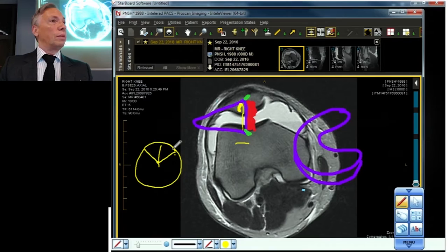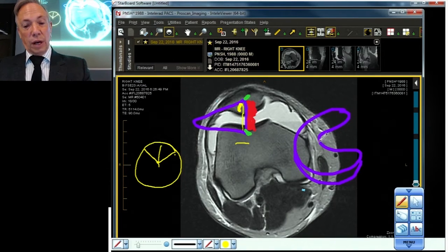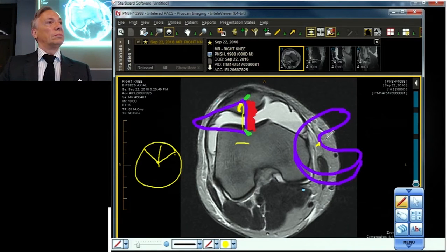Kind of like the wheels on the bus go round and round, right? So what does that look like? Well, here's the spoke on the wheel right here. It's coming right at you. Sometimes it makes a little V. That's a radial tear. And that goes into the screen. That also goes up and down. It's just in a different axis.